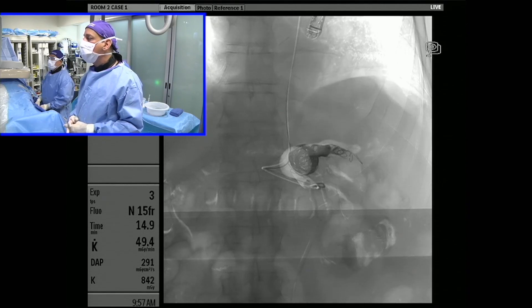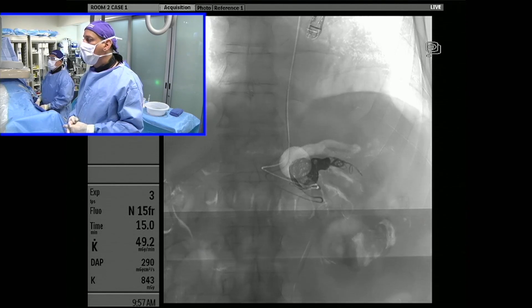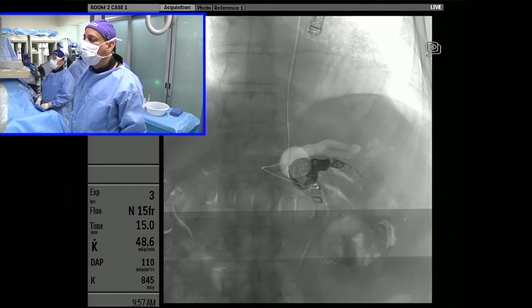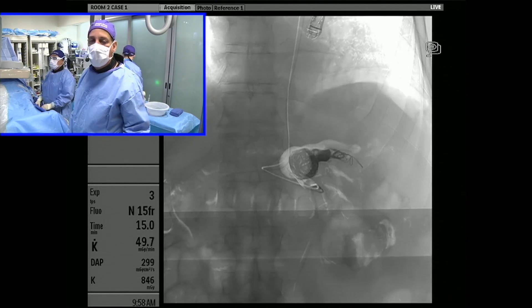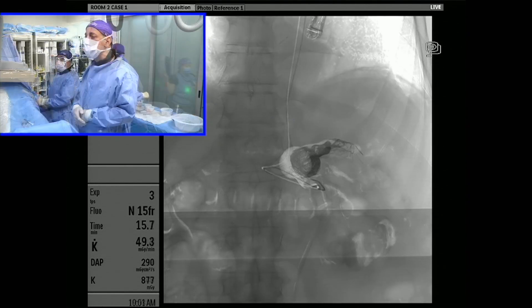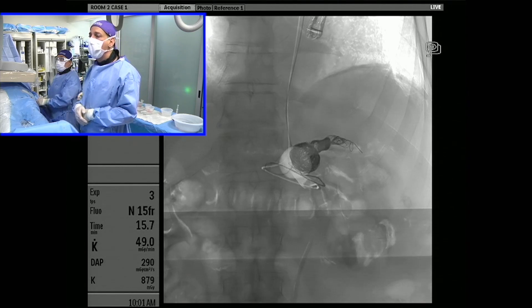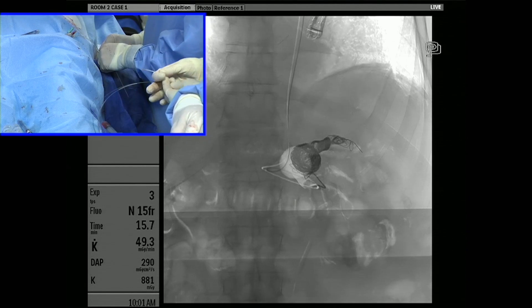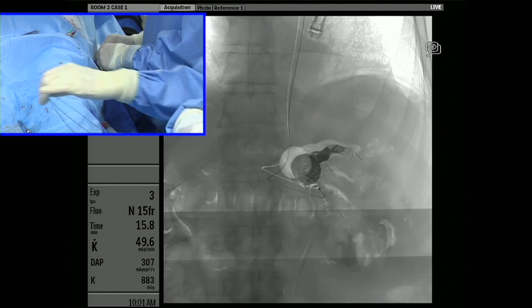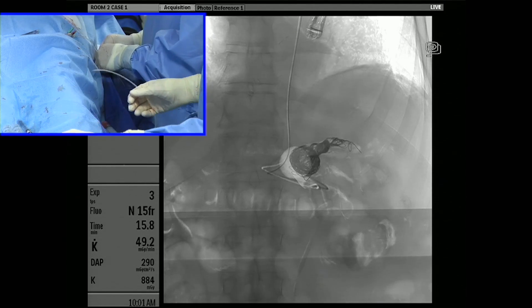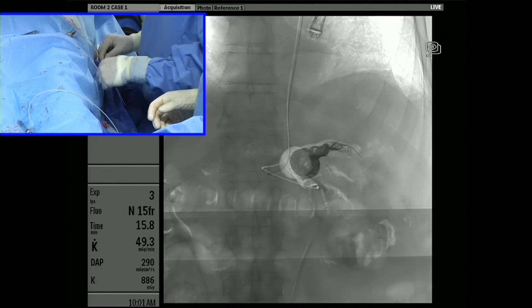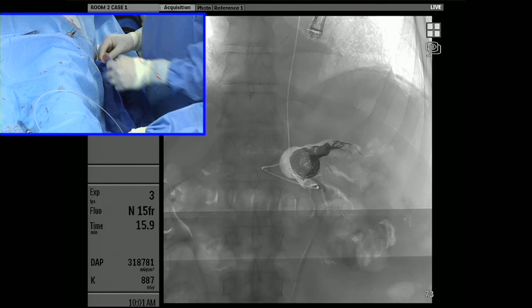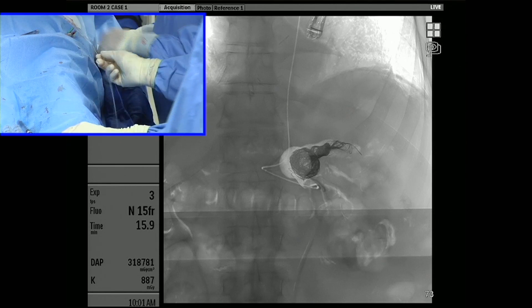I think we're going to be kicked out of the aneurysm very soon, and then I'm ready to switch over to one or two 035 coils to seal up the inflow and we'll be done. We're actually putting in the 035 coil right now. As you can see, it's packing up the space nicely. We'll probably put in one or two more of these and then we'll be done. This is a 035 interlock detachable coil.